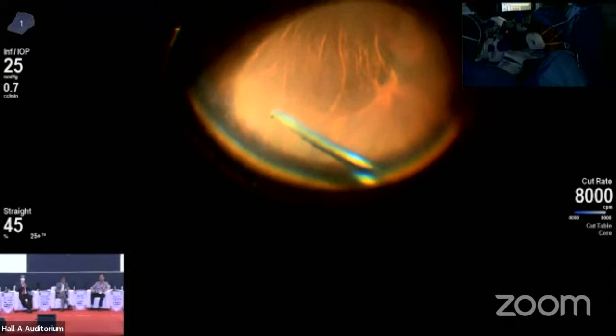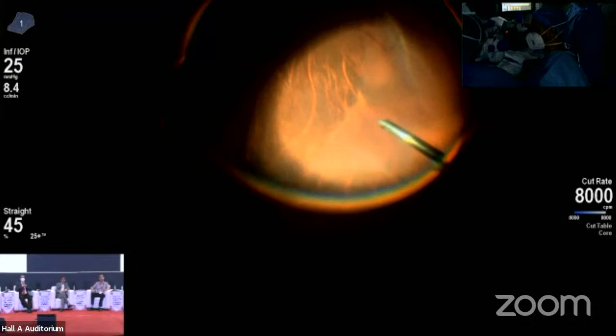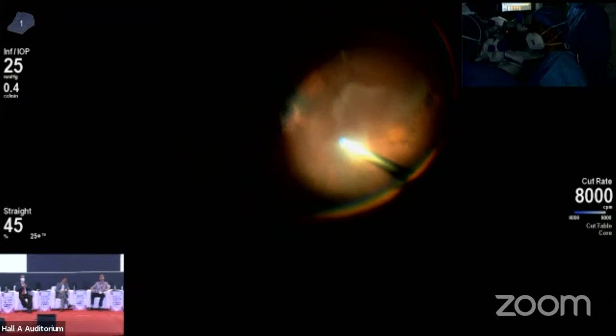In the other eye, is there any predisposing lesion? Dr. Nawajis is the surgeon who is assisting. Yes, sir. And Dr. Nawajis just informed me that there is a single horseshoe-shaped tear in the other eye at 12 o'clock. We plan to laser that tear tomorrow. In this eye, it is almost a big tear or giant retinal tear?